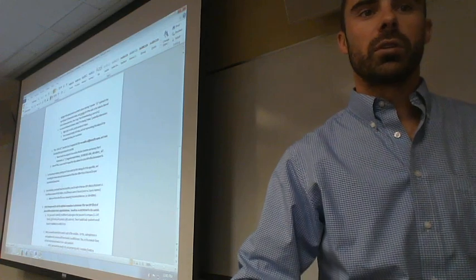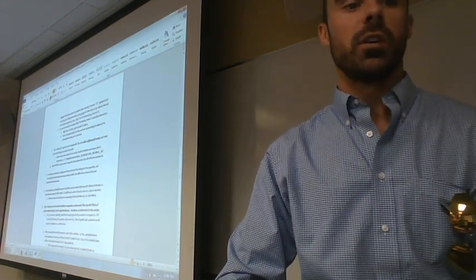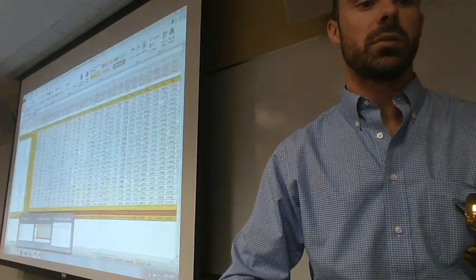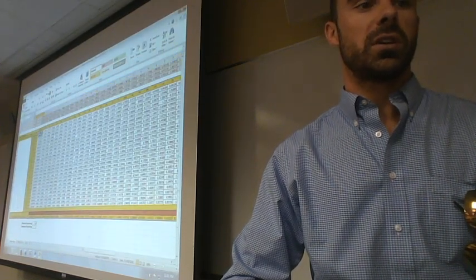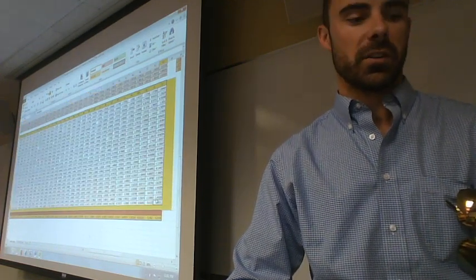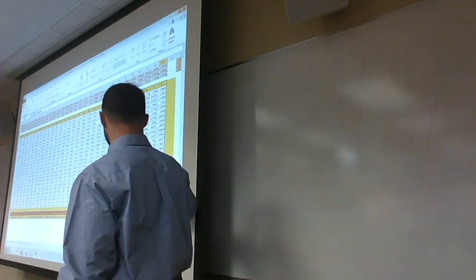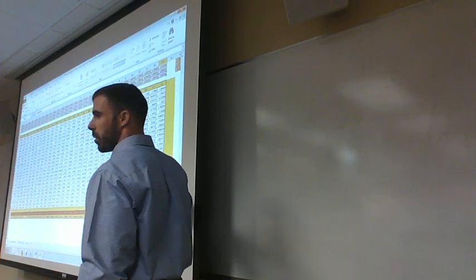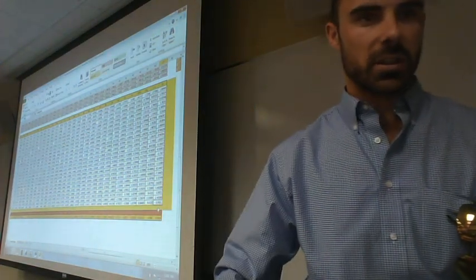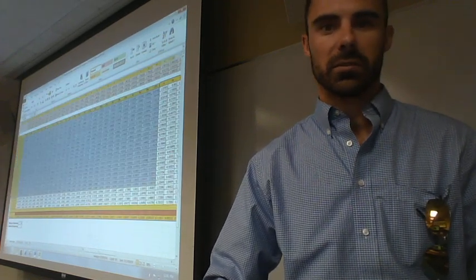Now, what we'll do is we will highlight the data in the yellow table. That is our range normalized output. And we're going to copy that too, and we're going to put that in a new sheet. So what we can do is we can take all of this, just like that. So first of all, see how if I click in this box, right, this is still a formula, AH63 divided by BO63. So this is not just a number, this is a formula. So what we want to do is make it more of a number, escape out of there, and we're going to create another sheet here.